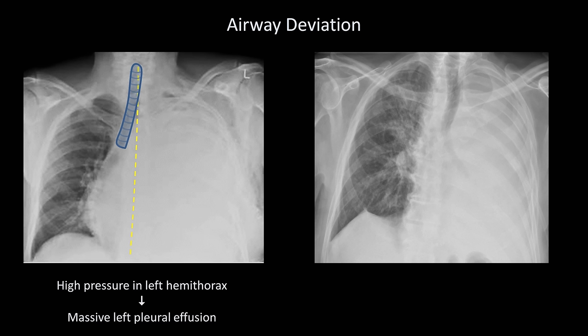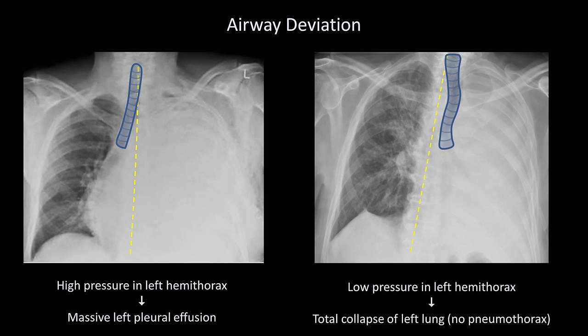The x-ray on the right is a little trickier — it would be easy to mistake this for a pleural effusion as well. However, drawing our midline, which ends up being crooked because the patient is crooked, you can see that the trachea is deviated towards the whited out side. Therefore, there must be low pressure in the left hemithorax, which can be due to collapse of the left lung — not from a pneumothorax, but rather from something like left main bronchus obstruction from a tumor.